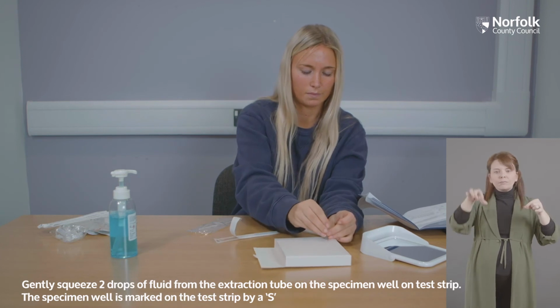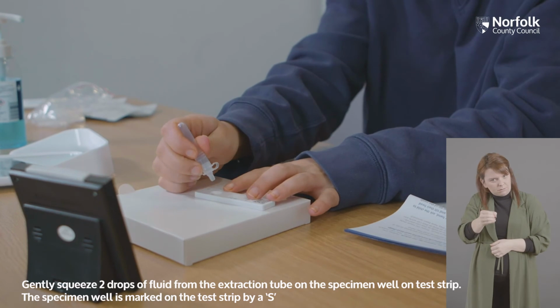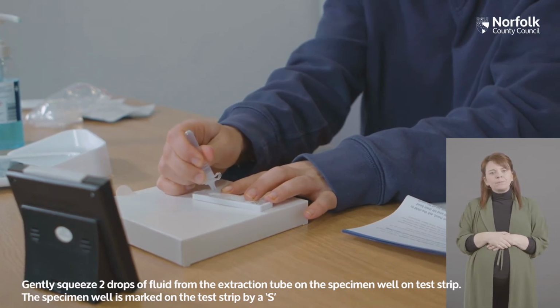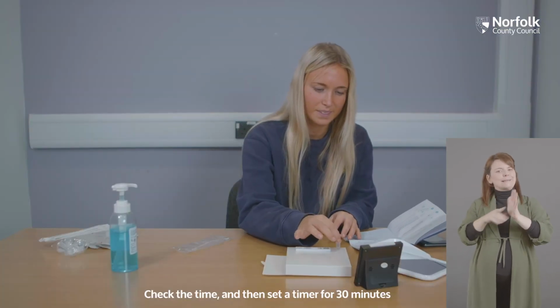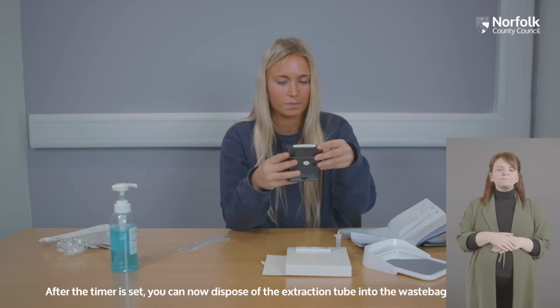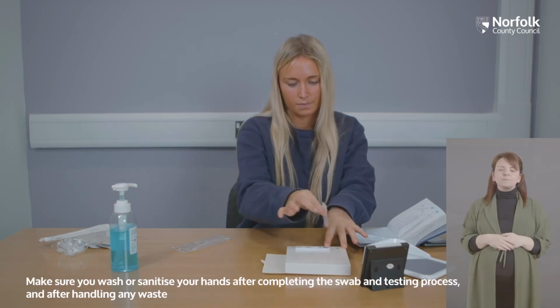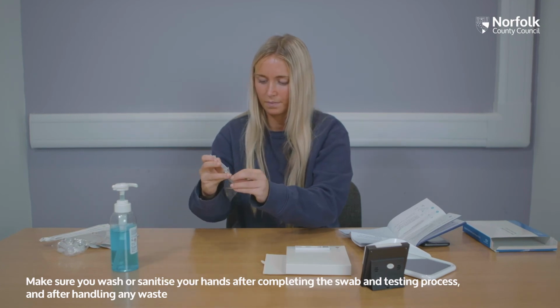Gently squeeze 2 drops of fluid from the extraction tube onto the specimen well on the test strip. The specimen well is marked on the test strip by an S. Check the time and then set a timer for 30 minutes. After the timer is set, you can now dispose of the extraction tube into the waste bag. Make sure you wash or sanitize your hands after completing the swab and testing process, and after handling any waste.